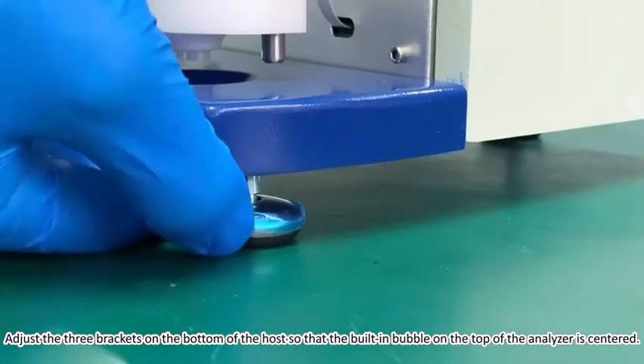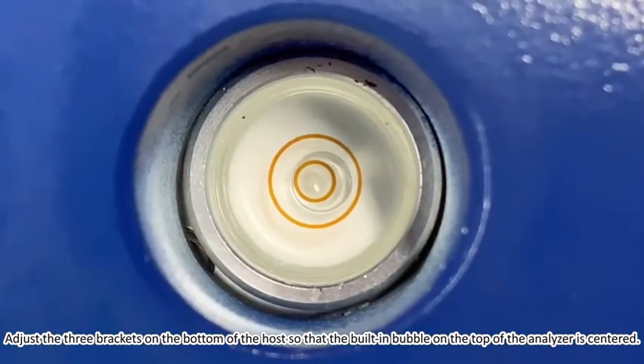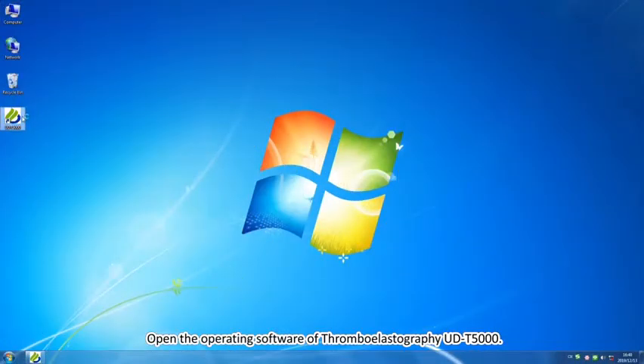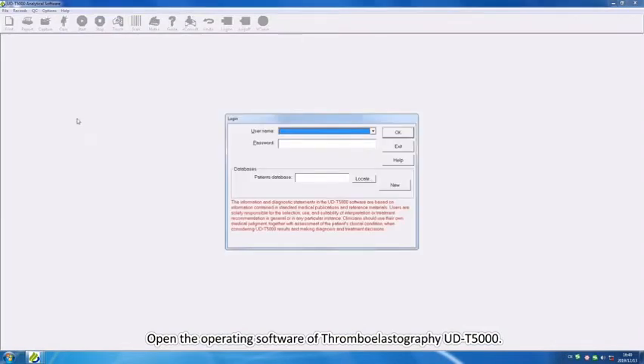Adjust the three feet on the bottom of the host so that the built-in bubble level on the top of the analyzer is centered. Open the operating software of the Viscoelastography UDT5000.